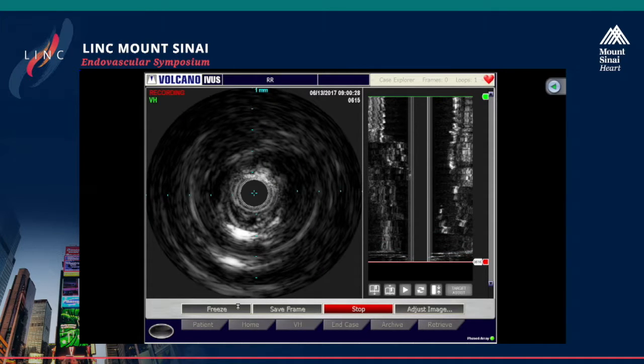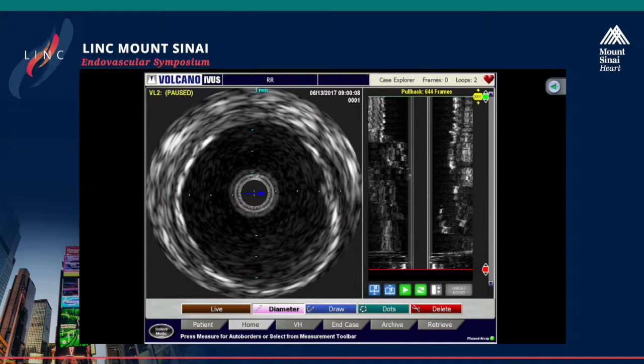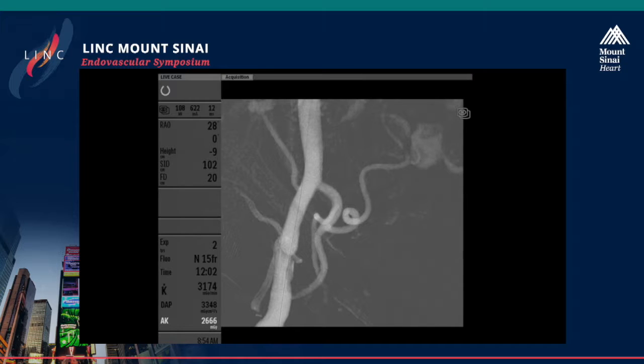My fear here a little bit to implant a Supera is that I'm not sure if there is some thrombus. So we know that you have to do a perfect vessel prep before you implant a Supera, and perfect vessel prep in this situation can create distal embolization. And I'm always struggling with the fact, as a surgeon, that the deep femoral artery is the holy artery for us. So I agree that we need to protect this SFA and the below-the-knee vessels, but I'm also in doubt if we can allow just distal embolization to this deep femoral artery.